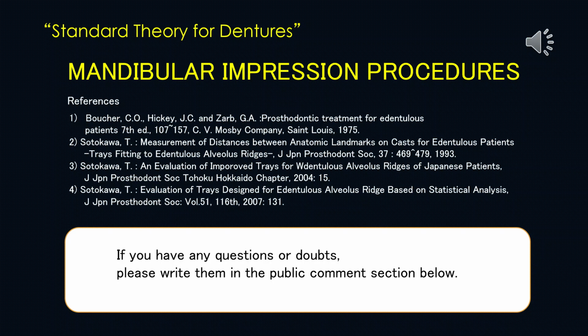Standard theory for dentures. Mandibular impression procedures are now complete.